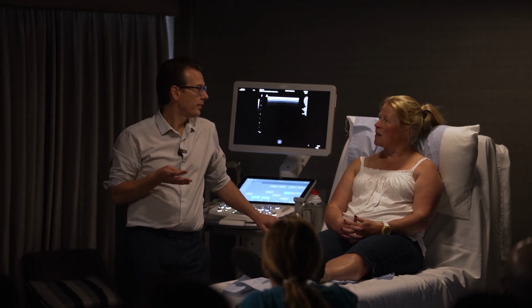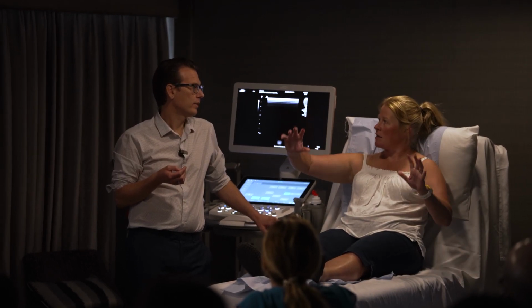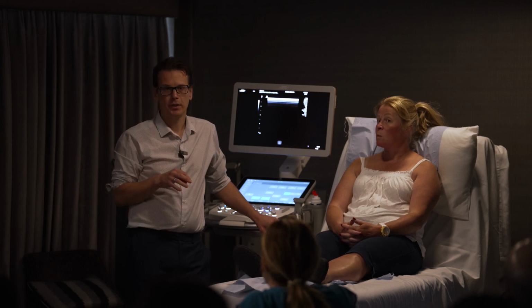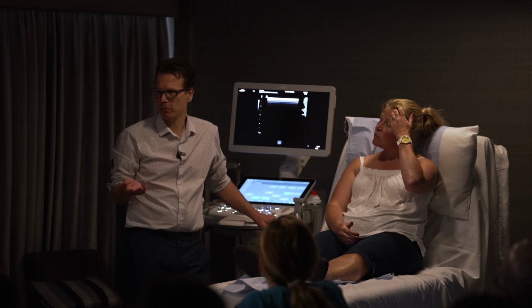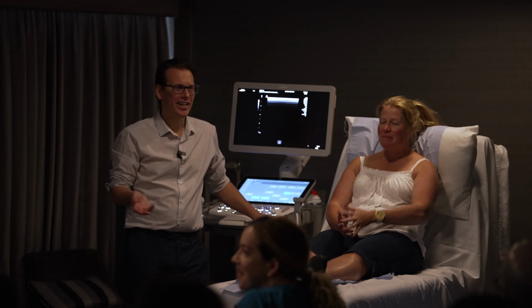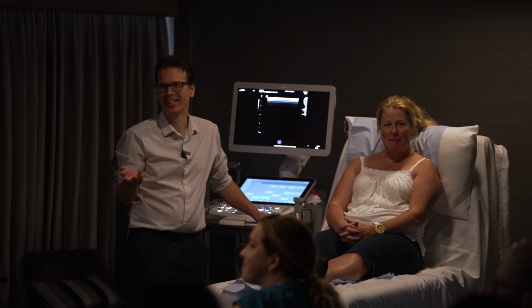I know Jerry scans sitting down, doesn't he? The sonographer on the same side, he sits down, but it's still shoulder height, but he sits rather than stands. It's just personal preference, what people do. I've started to stand up because I think I spend most of my working day sat, so it's one of the few times I get to stand up.